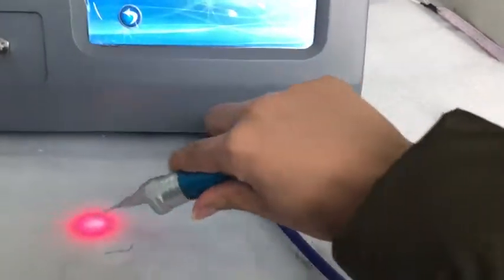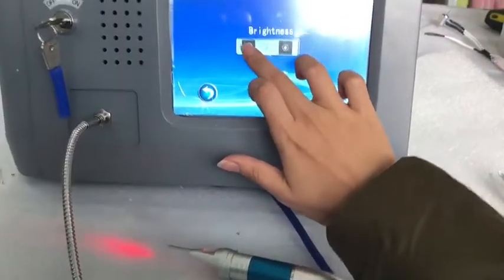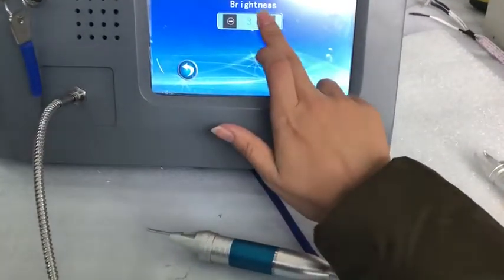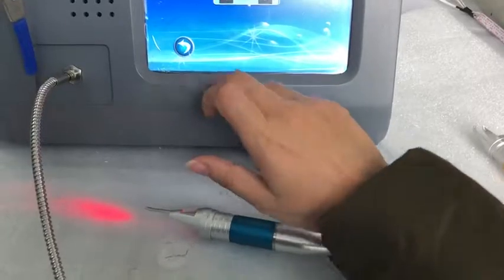You can see this. And when we reduce, you can see the red. There is no red, so we should increase. Should be eight or nine. It's okay.